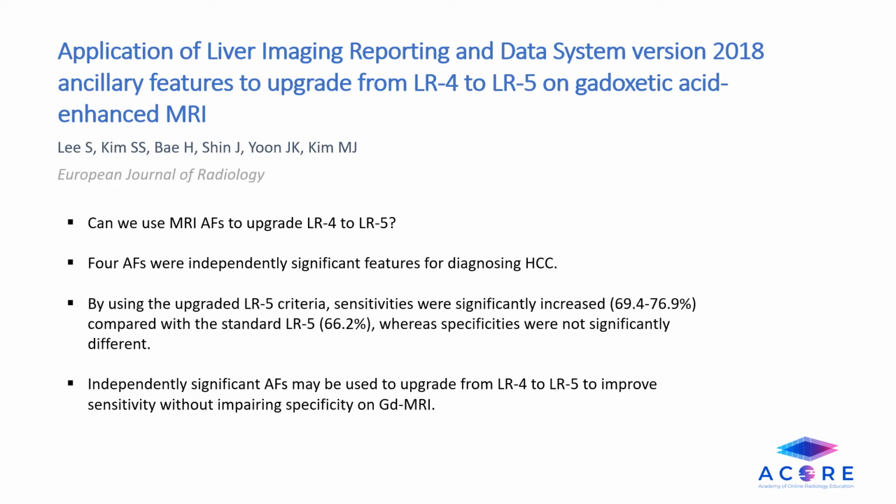Therefore, the authors concluded that we can use the independently significant ancillary features to upgrade from LI-RADS 4 to LI-RADS 5 to improve sensitivity without impairing specificity on MRI.